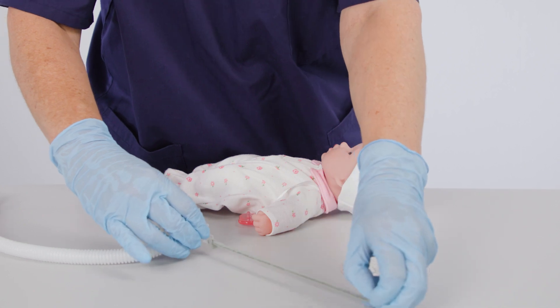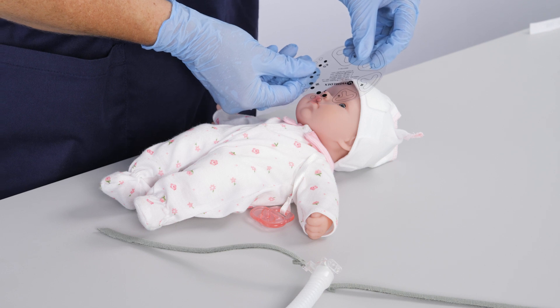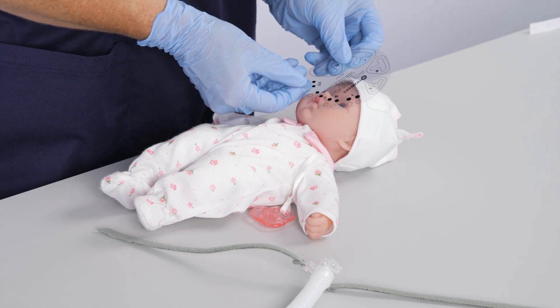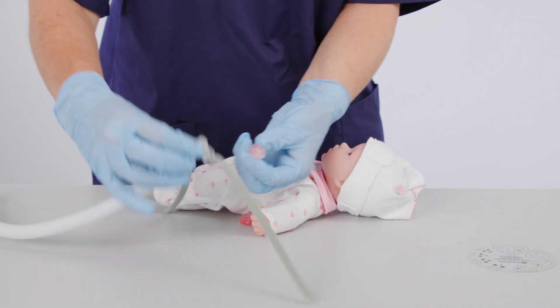Measure the infant's nasal size using the measure guide provided with the NCPAP generator. Attach the prongs to the generator.